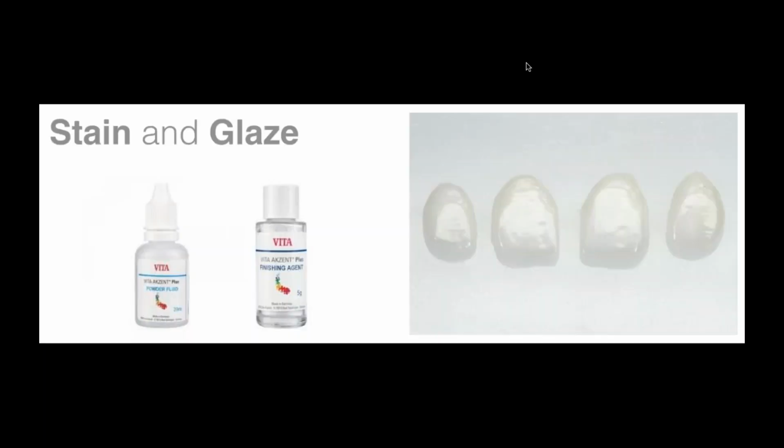There are different types of glaze and stains that VITA offers, and I always discuss with Jim that I like a more natural surface texture. If you evaluate the restorations that you see in your patients' mouths, ceramic restorations are most of the time much more glazed, polished, and fake looking than natural teeth.